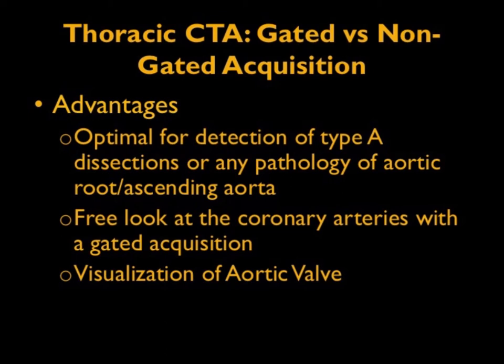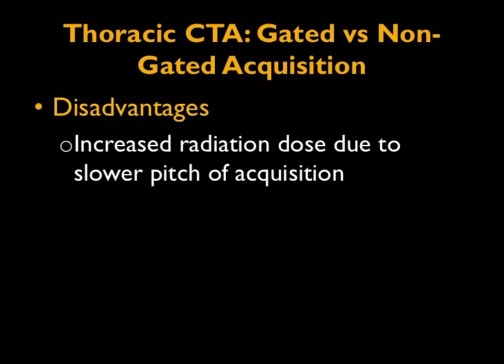And you also can get routinely good visualization not only of the coronary arteries, but of the aortic valves. The main disadvantage, and really the only key disadvantage of gating a study, is the fact that there's increased radiation dose due to the slower pitch of acquisition.